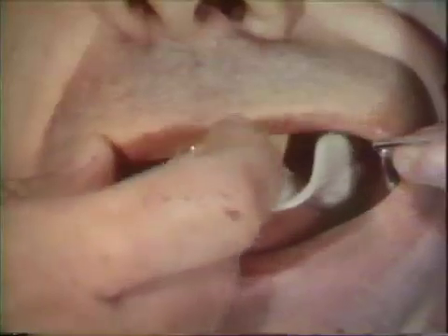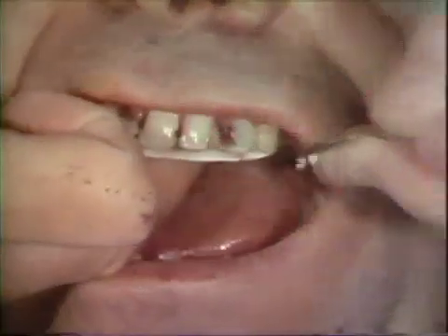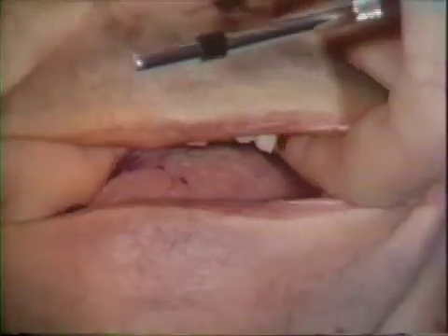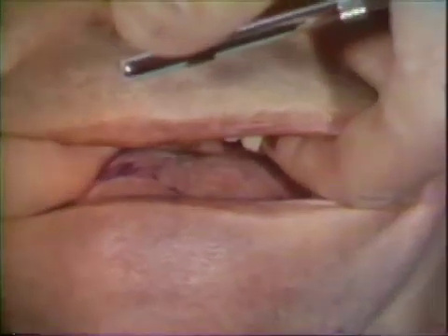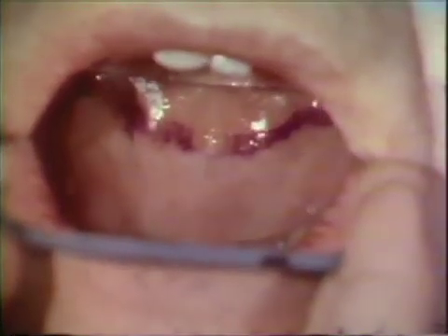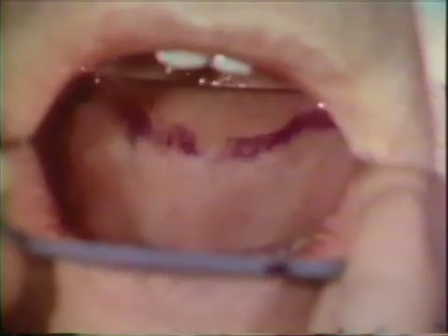The tray is again inserted into the mouth. The patient is instructed to move the soft palate by eliciting a long, drawn-out sound. The indelible marking is transferred to the palate. The operator can determine whether the pencil marking coincides with the junction of the movable and non-movable tissue. The excess compound is trimmed to this line.